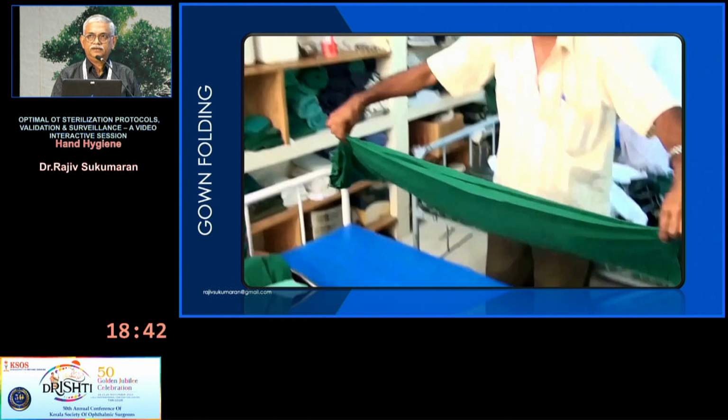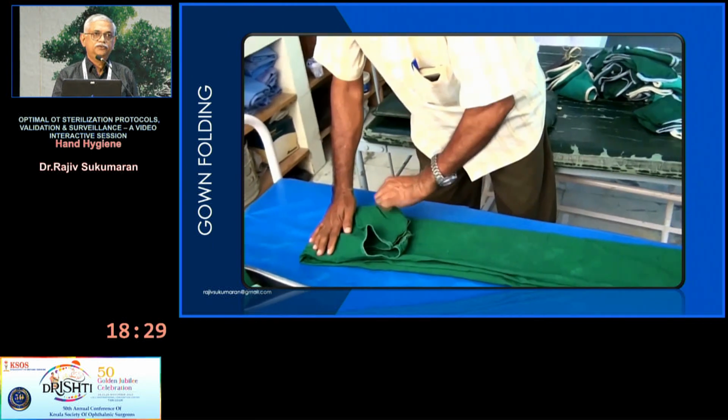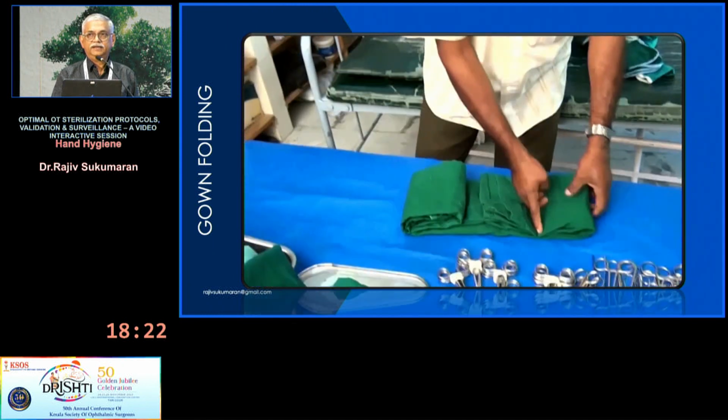Now, most of us have changed to disposable gowns, but if we are still using the older method, especially in government hospitals, we use this reusable cloth gown for surgical gowns. But look at the way he is folding. It looks very nice, everything.